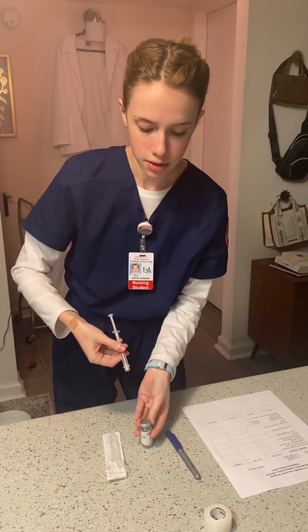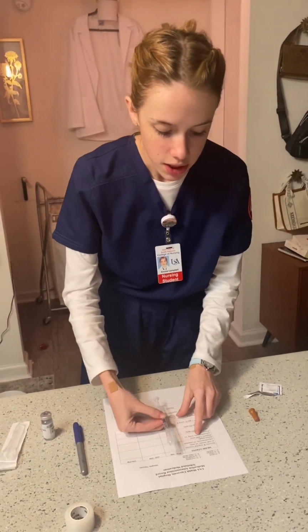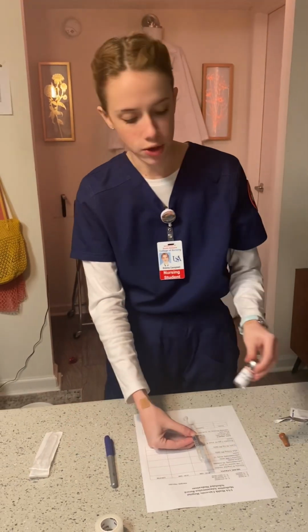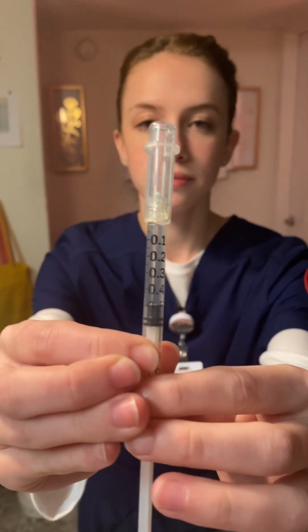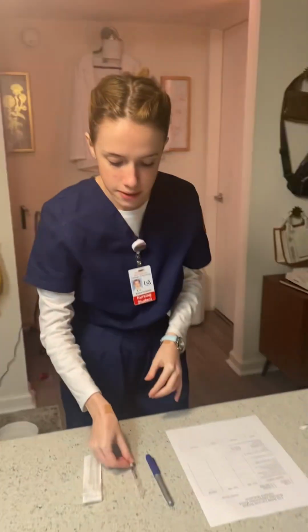All right. I'm going to go ahead and put the safety up, and then I'm going to verify this dose again. So 5,000 units of heparin. As we saw in our vial, 10,000 units per 1 milliliter. So we would calculate the dosage to be 0.5 milliliters. I would also verify this dosage with another nurse. I'm going to go ahead and show it to the camera. All right, perfect.